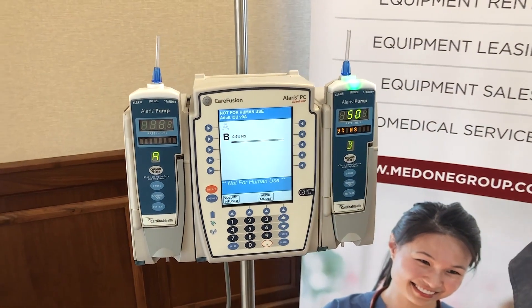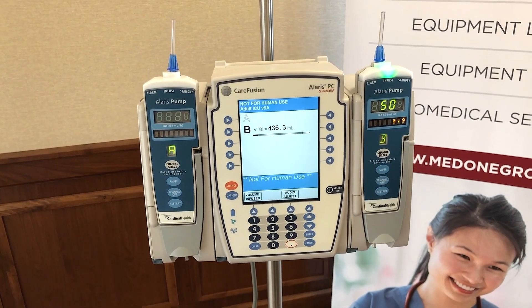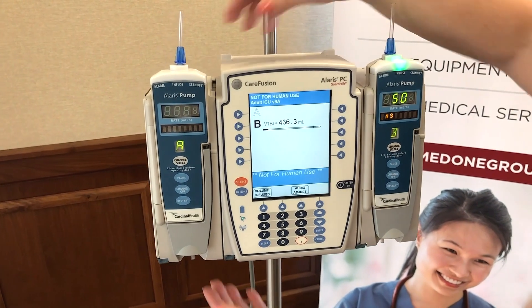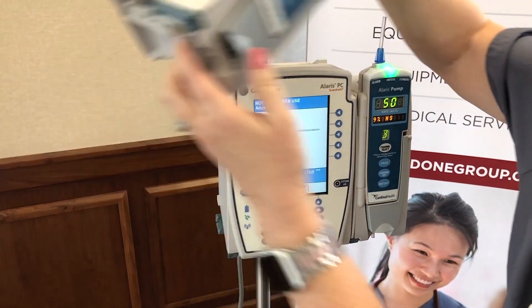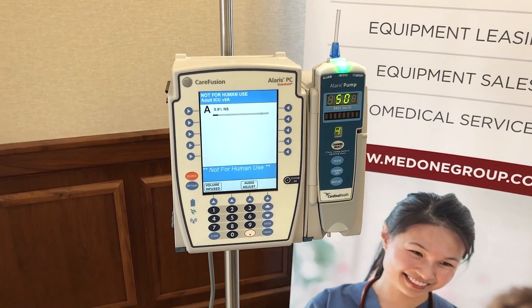That module can now be taken off by depressing the blue button on the bottom right of the PCU, lifting it off, cleaning it, and then giving it to another clinician who may need another module.